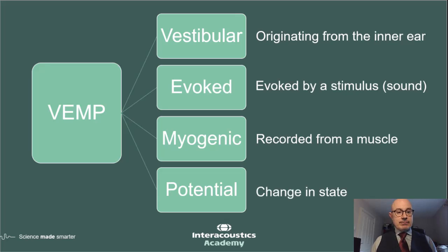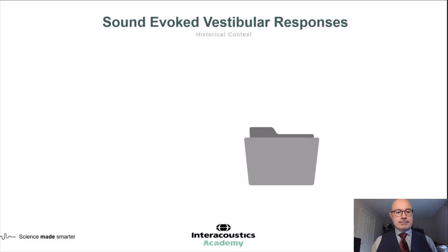And it's a potential. A lot of the potentials we measure in audiology are things that change in state. So we stimulate, there is a change in state, and we measure that difference and look at that as a reflex or as an electrical impulse.